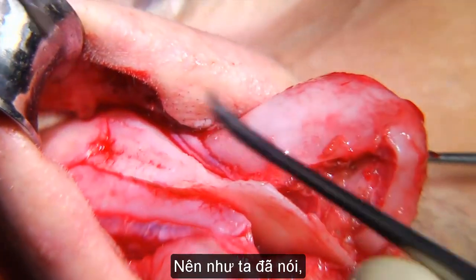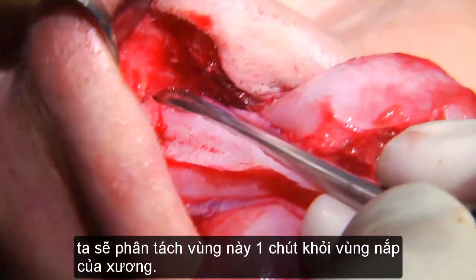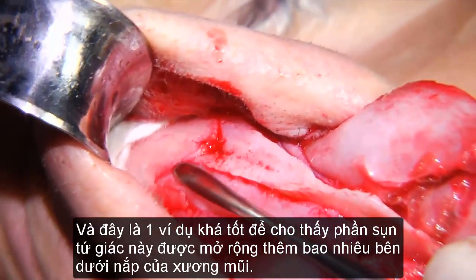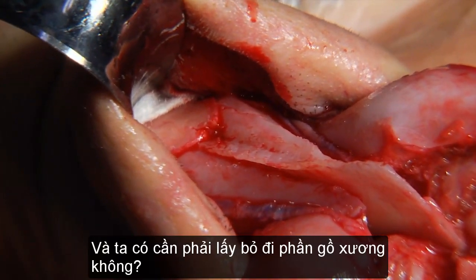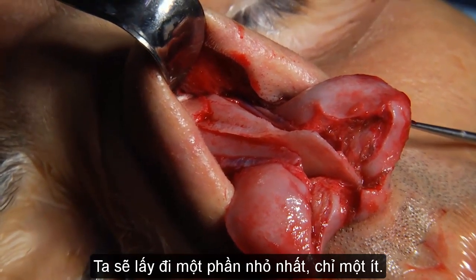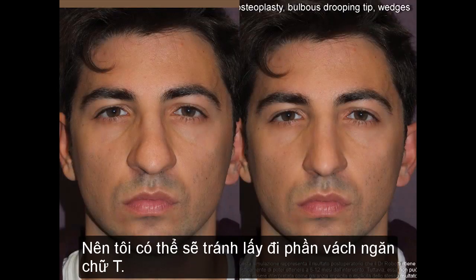So having said this, let's separate this a little bit from the bony cap. And this is a good example to show how much this cartilage extends below the bony cap. And do we need to take this hump down? We will take a minimal portion down, just a tiny bit.